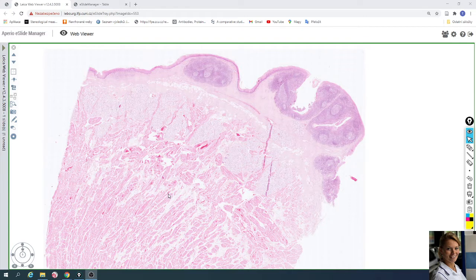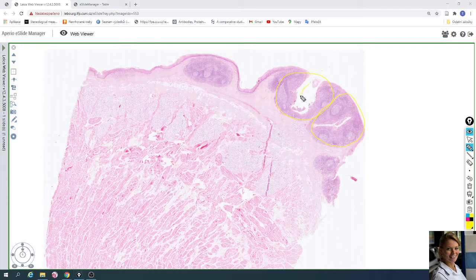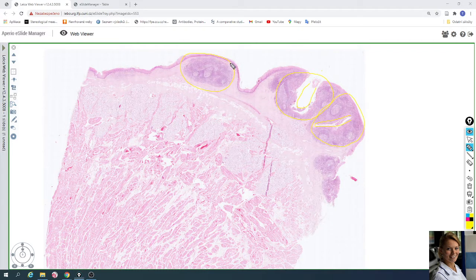The lingual tonsils are an aggregation of small individual tonsils. For example, here each tonsil has a tonsillar crypt. This is a small tonsil with a crypt. Here is another crypt of another tonsil, and here is a last tonsil.